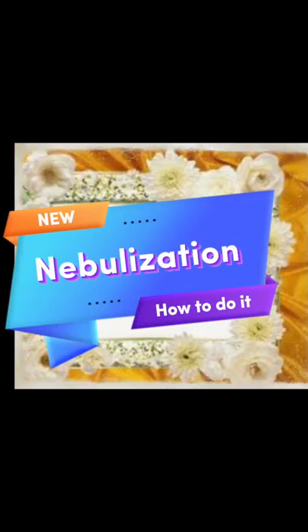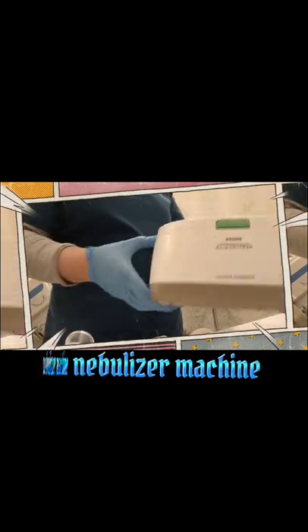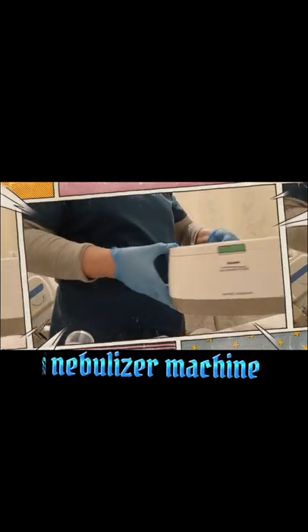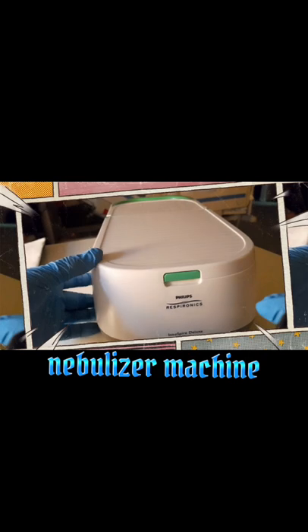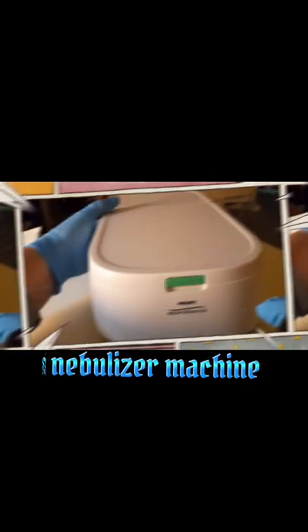First and foremost, we need to have a nebulizer machine. The brand name is Philips Respironics. This is a portable, lightweight, and handy nebulizer machine. You can carry this anywhere on the go because it's very comfortable to handle.